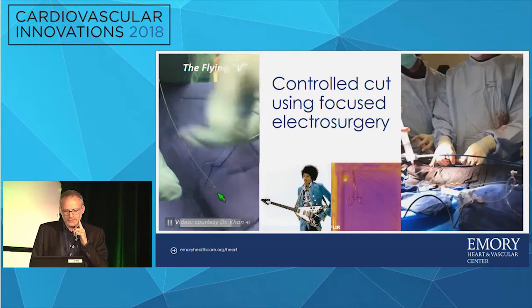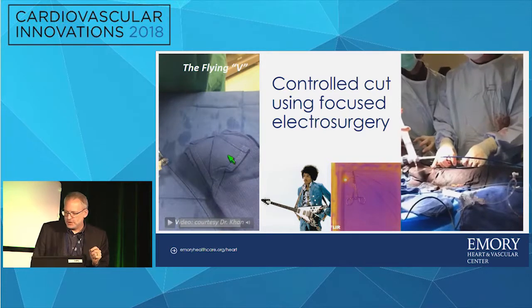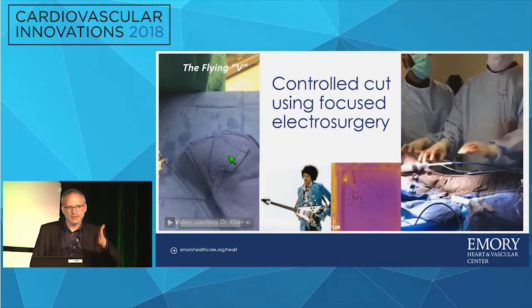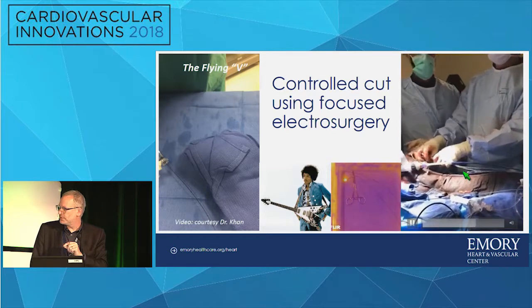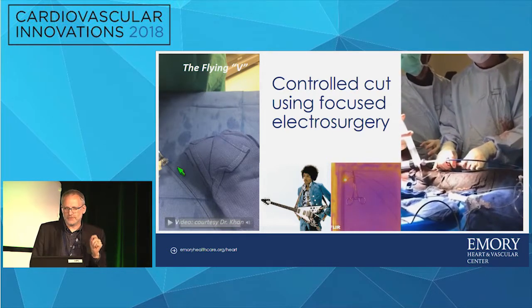But to get the wire to electrify out the side, this is a bath showing that you can do it, you need to denude a little bit of the wire and kink it so that the denuded part is on the lesser curvature of the wire, because electricity wants to go out the greater curve. Think about it. If you bend a wire, the electricity wants to go straight. So if you make the flying V correctly, it's a very easy pull. But you have to know that that's the secret. You have to create the flying V.